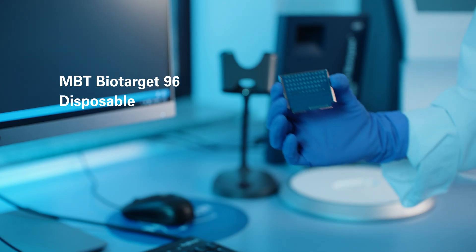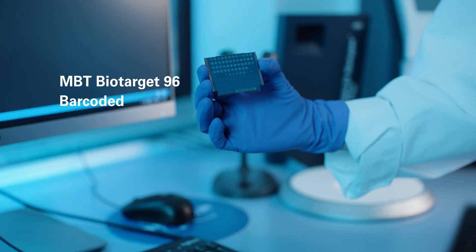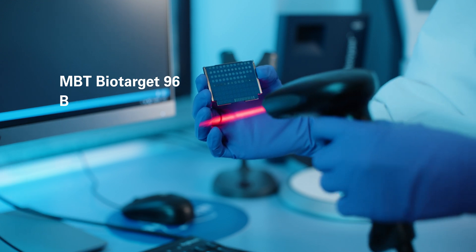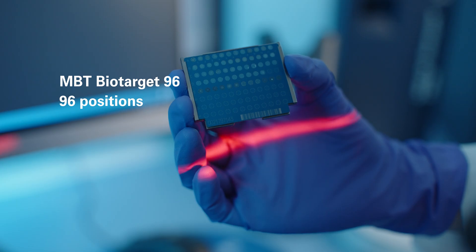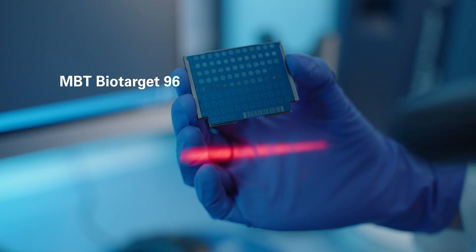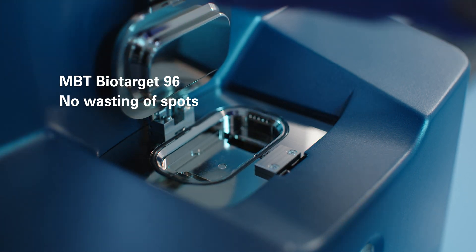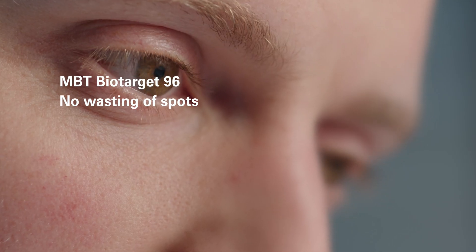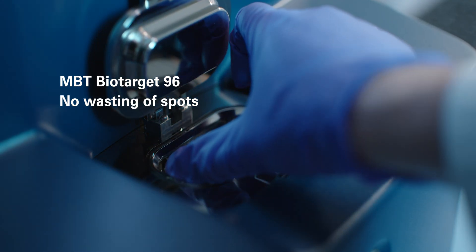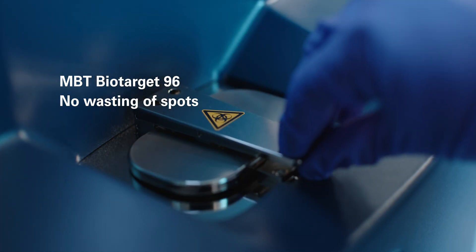Disposable, barcoded MALDI targets have 96 sample positions that can be filled incrementally, always fitting the size of your sample run without wasting any spots.